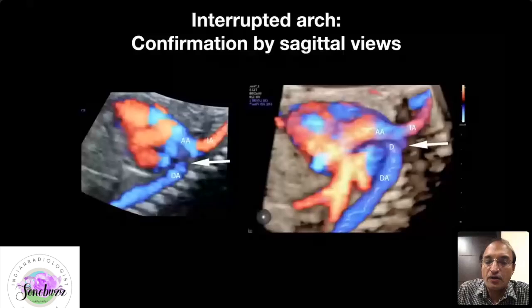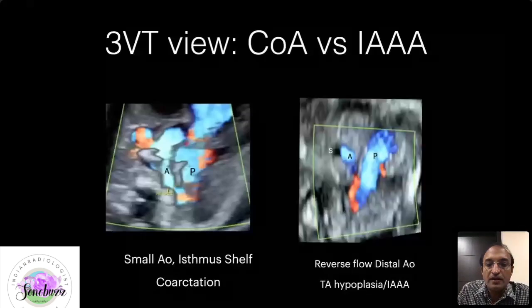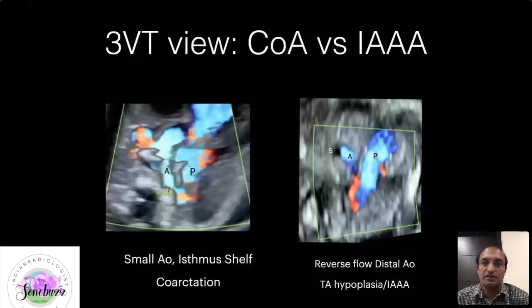In coarctation, the aorta is small within itself, while the classical feature of interruption is reverse flow — you see red flow on the aortic side because the aorta is not extending down, with retrograde flow through the ductus arteriosus. This second picture is very critical because it suggests the baby is going to be born with a severe critical circulation after birth.